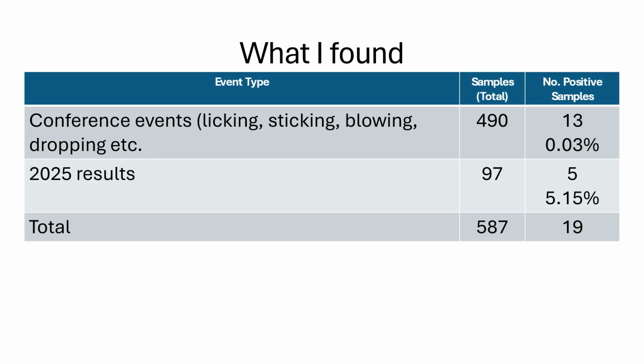And this is not to imply that you shouldn't follow these protocols that they're going to be going over. It's that if in fact you get a positive, you should really probably think that it's in the water and go right after it. I managed to get 5 positives out of the 97 samples that I collected. And we didn't do 100 because Andy can't count. But still, out of the last 500, I only got 13 positives. This one was good. It was a groundwater system that was just free chlorinating. We'll do it again next year with the surface water, and we'll see how it goes.